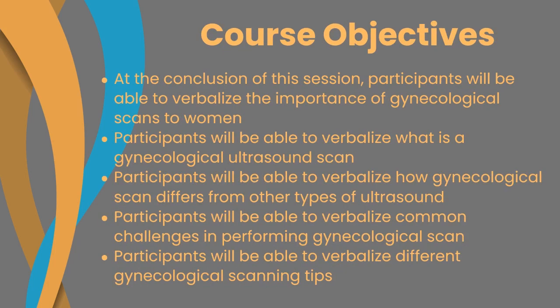Course objectives. At the conclusion of this session, participants will be able to verbalize the importance of gynecological scans to women. You'll be able to verbalize what a gynecological ultrasound scan is. You'll be able to verbalize how it differs from other types of ultrasound. You'll become familiar with the common challenges in performing gynecological scans and different scanning tips.